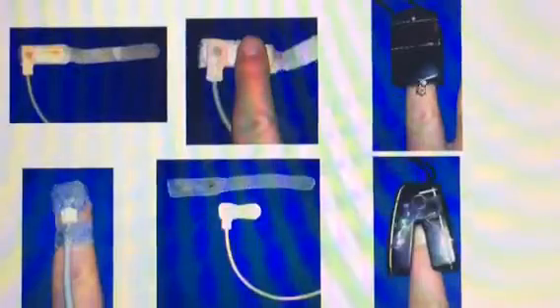This is a different type of pulse oximeter for the finger, and as you can see it can be placed right over the top of the finger. If the person has a lot of dark fingernail polish, you can turn it sideways so it'll shine through the side of their finger. Typically the light is placed on the fingernail, but it can be on the bottom or side as long as the receiver is on the opposite side of the finger to catch the signal.